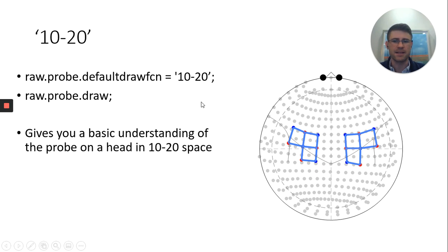Well, you can select the 10-20 option, which would be raw.probe.defaultDrawFunction, and you write in 10-20 in apostrophes. And then you go ahead and draw it, raw.probe.draw. You get something like this, and you get this kind of looks like a shrimp to me, where you have little black eyes near the nose, you have the EEG coordinates, 10-20 coordinates, and then you have the probe laid out. You can see it's not perfect on that, but it's within reason. This gives you a basic understanding of the probe on the head in the 10-20 space.